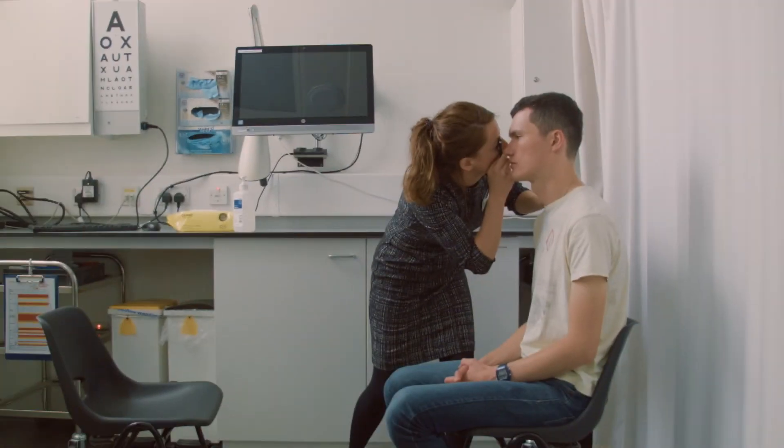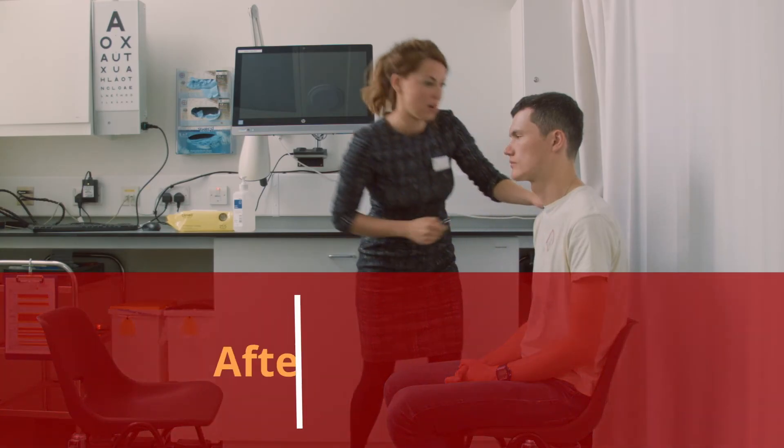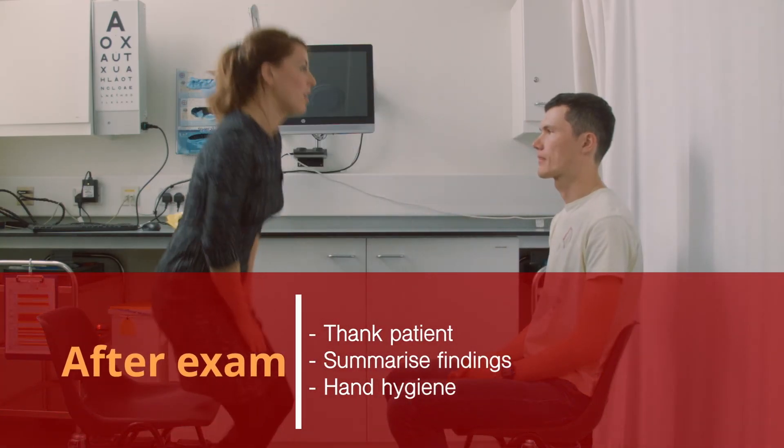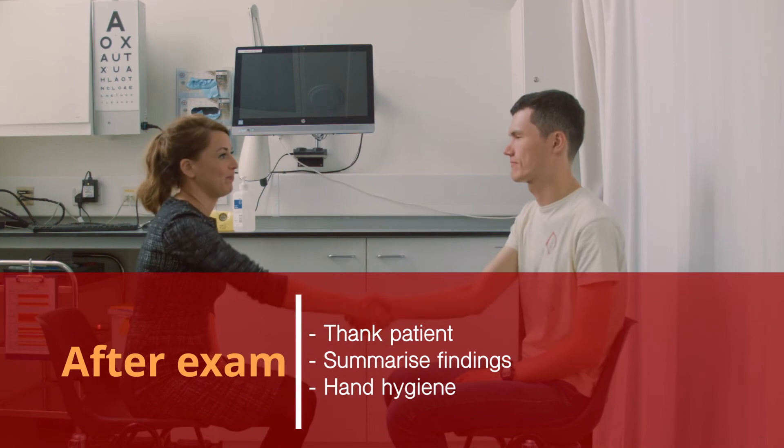Repeat this examination on the other eye. After the examination, thank the patient, summarise your findings and repeat hand hygiene.